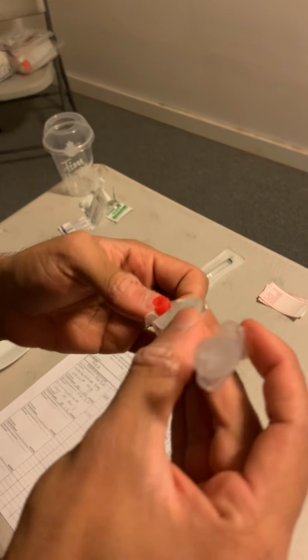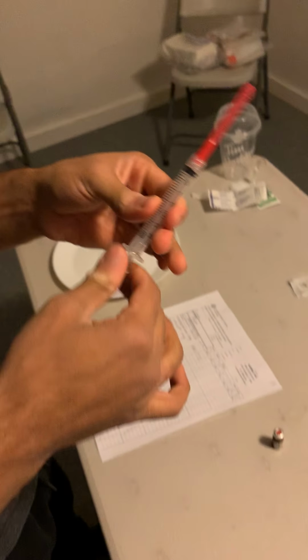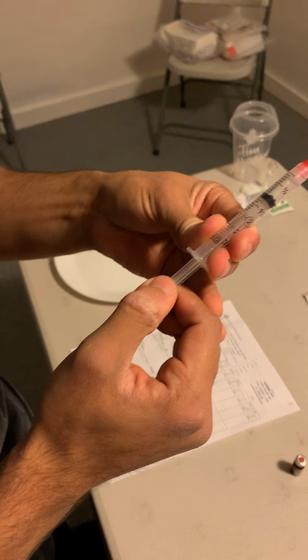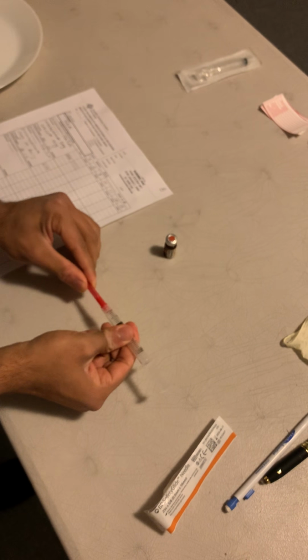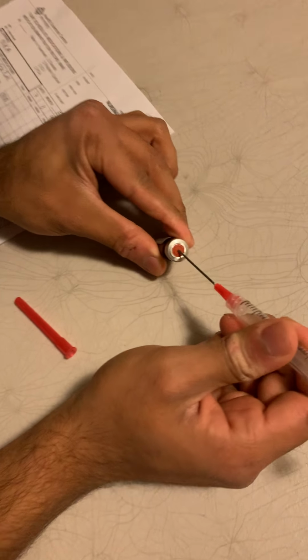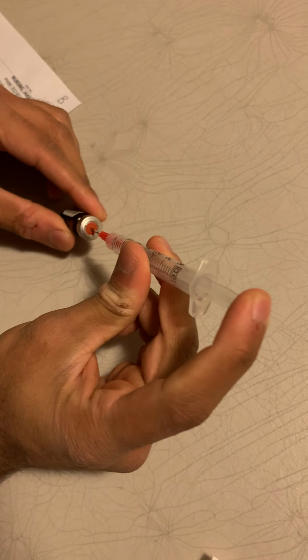Now I'm going to be getting my blunt fill, locking that onto the syringe. Now I'm going to be pulling the plunger back to about 1 ml, which is what I'm going to be injecting into my vial. I'll be injecting that.